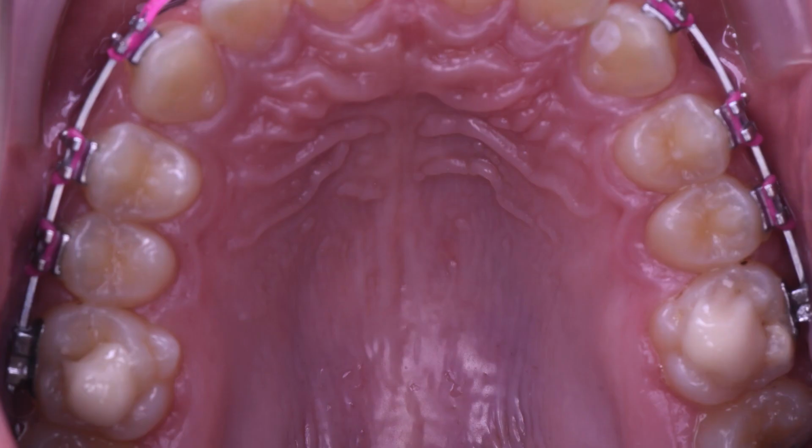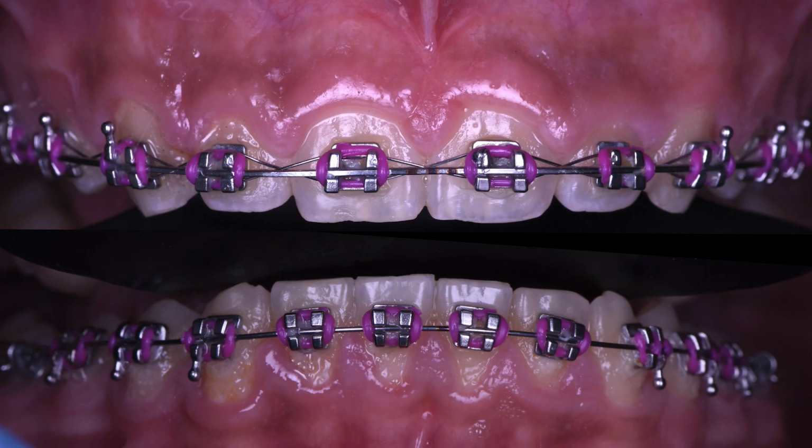Because the patient has a deep bite, I need to raise the bite, and I prefer to raise the bite here on the palatal cusps of the first molars bilaterally. In some cases of deep bite, if you have a decreased overjet like class 2 division 2 cases, you can raise the bite palatally beside the upper incisors. But in this case, because I have a slightly larger overjet, I raised the bite posteriorly on the palatal cusps of the first molars.